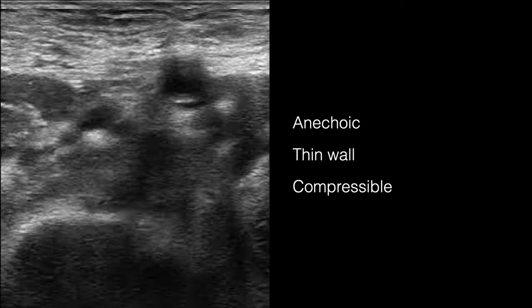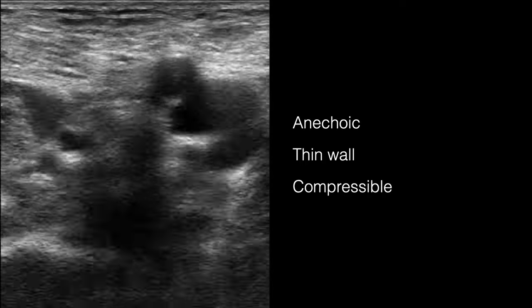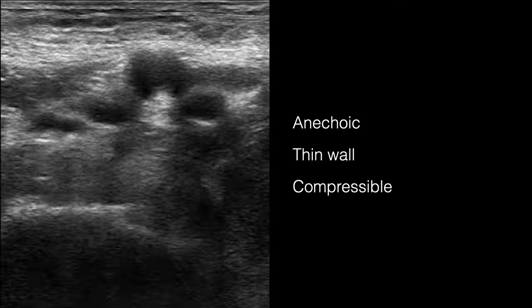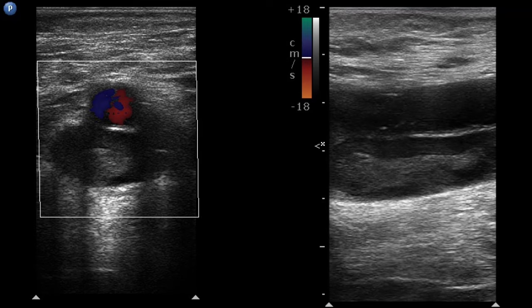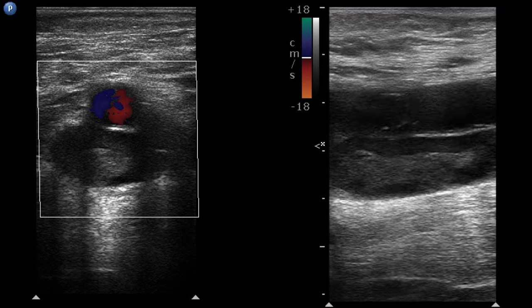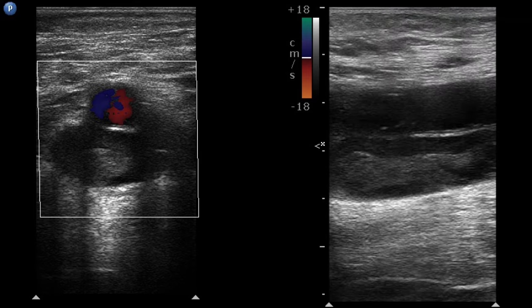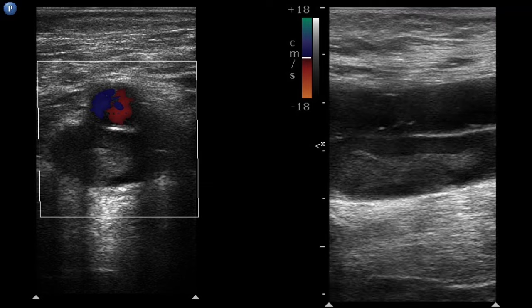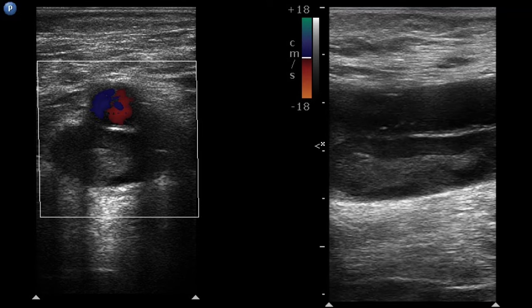When a DVT violates one or more of these principles, we have to ask why. A DVT will make the lumen not anechoic — there's something in there — and the vein will not be compressible. In short and long axis views, the walls of the vein will not collapse and touch each other; instead they'll collapse onto the thrombus. That non-compressibility is the bread and butter of DVT evaluation in the ED.